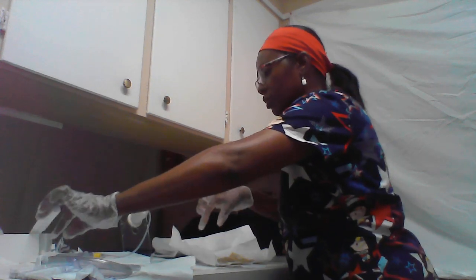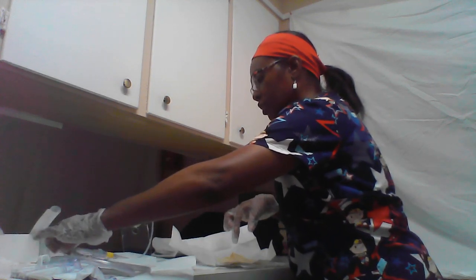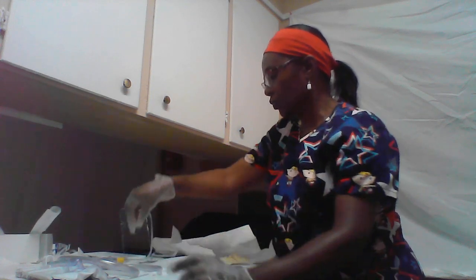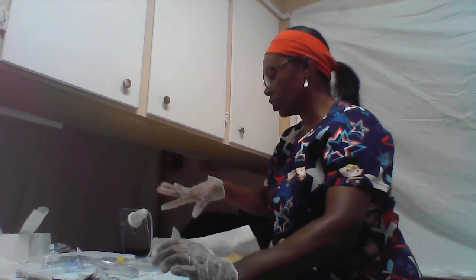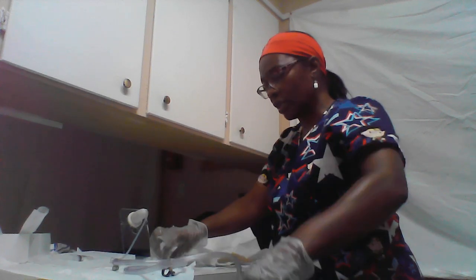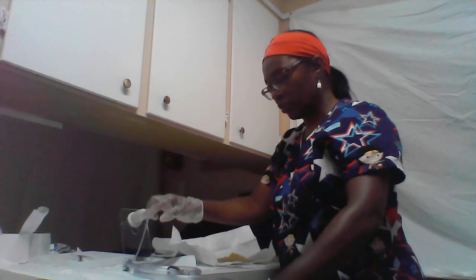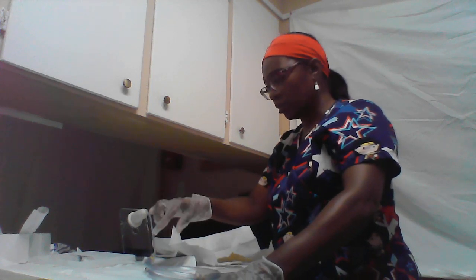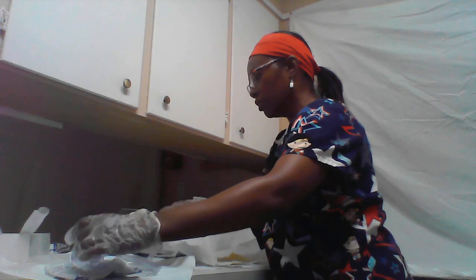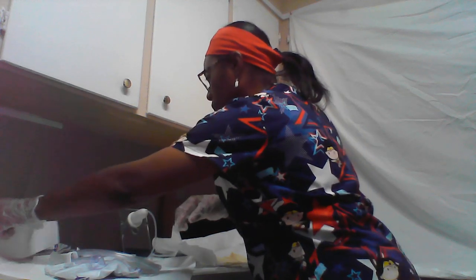And then I'm going to tape the catheter to the side of his thigh to make sure it doesn't come out, and make sure that I put the catheter where the urine can drain, and the urine is draining clear, nice clear yellow urine. And then I'm going to remove all the supplies, dispose of it in the biohazard bag in the garbage container.